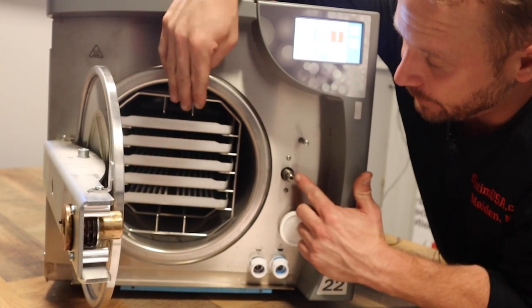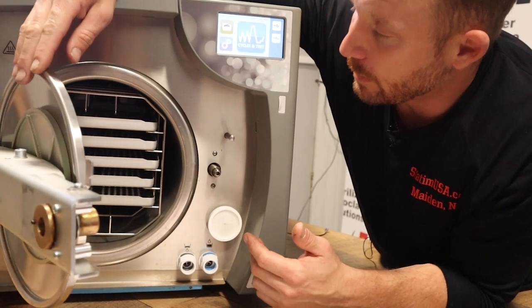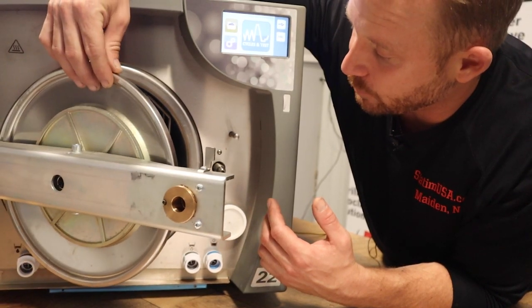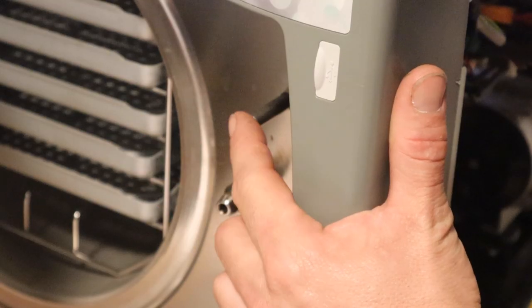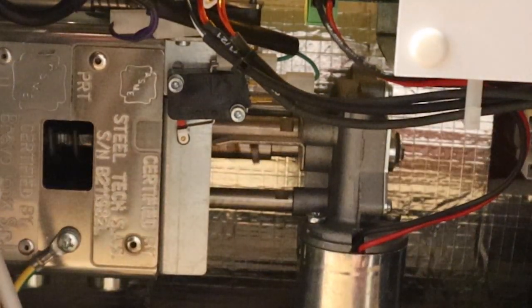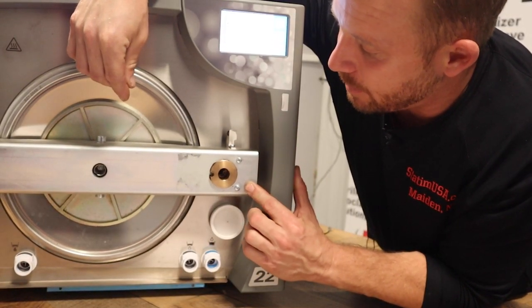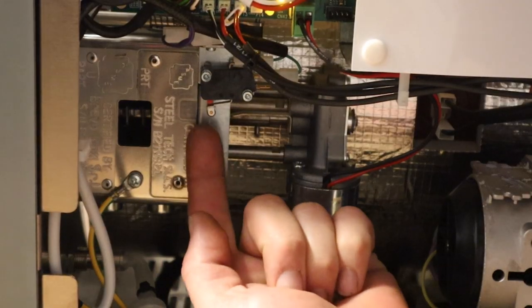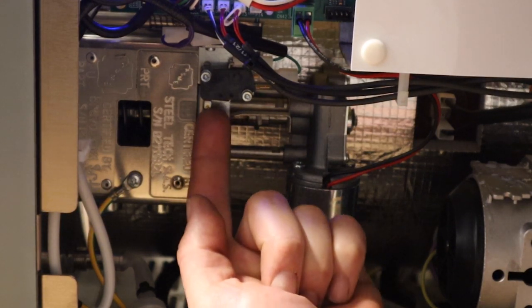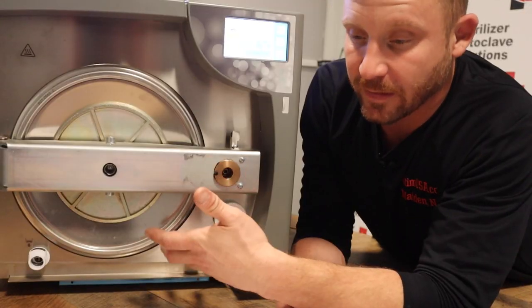First thing we would do outside of that is lubricate this gear motor. And then we would have to decipher if it was not recognizing that the door motor was in place. There's a switch here — as you can see, once I gauge that switch, it causes that to move. And then once the door is completely screwed down, there's also a switch on this side. So if your door's motor is spinning, that's a good indication that it's not the door motor and it's going to be one of the switches when you get this error.